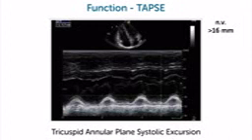So you would put the M mode tracing here into the annulus of the tricuspid plane, and then you get these excursions here, and you would simply measure from here to here. This distance is the so-called TAPSE, and in this case, we get a value of, I guess, 17 or so, so above 16, a normal TAPSE.